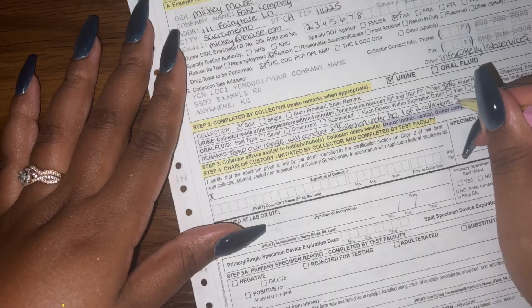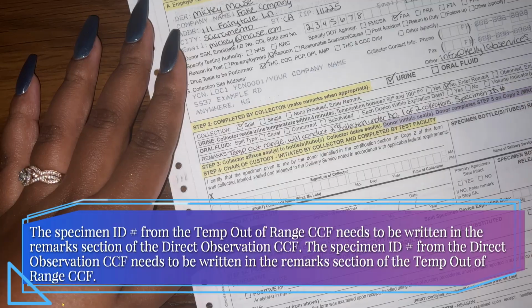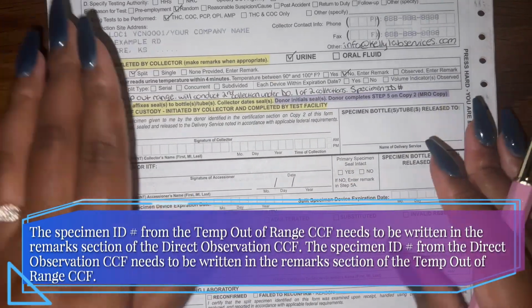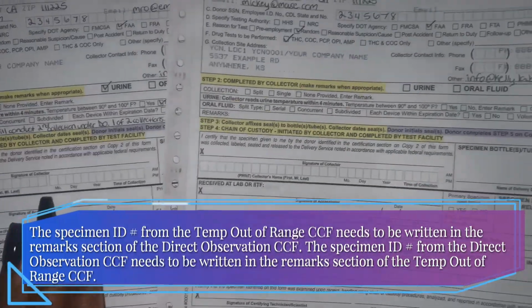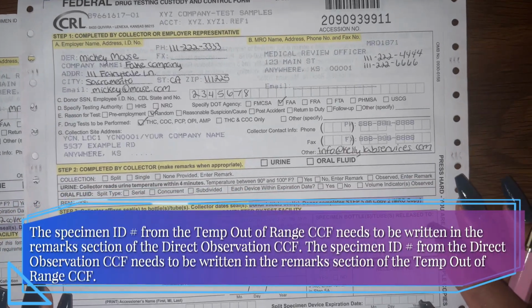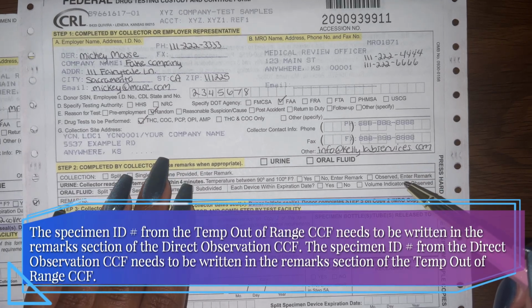Then we're going to write in specimen ID number. But the specimen ID number that we are referencing is going to be from our second CCF form that we're going to prepare after we do our direct observation. So here's CCF number 2. We're going to use this form to document the direct observation.